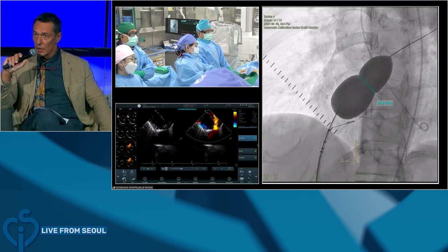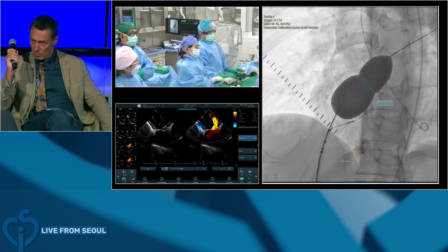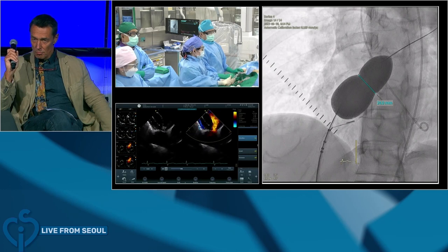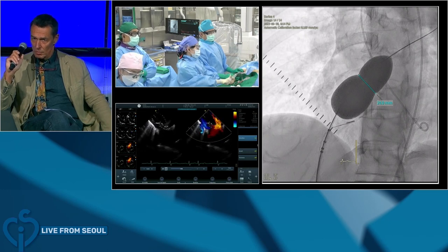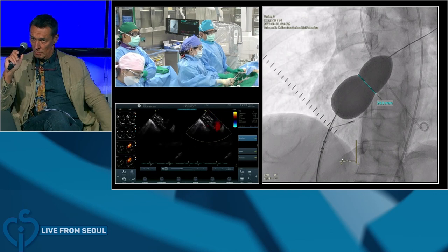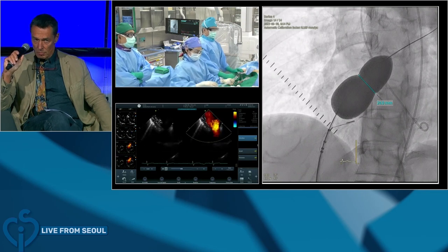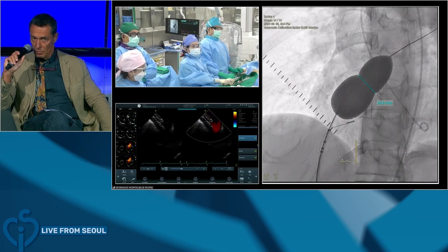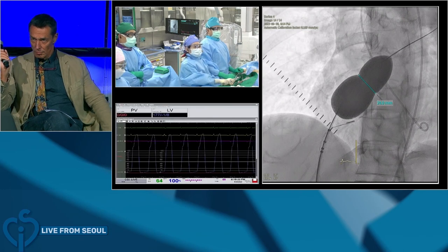Yeah, 24. Peter Ewert has a comment. I think it's a good idea to have this end-diastolic pressure measured, but it would be even more informative if we had the left atrial pressure directly. I don't know whether the balloon is stiff enough, but if you could measure the pressure through the balloon without a wire, because I would like to know how high is the V wave, so during ventricular contraction, what happens with the left atrium? Normally, if you have a restriction, you have V waves which are much higher than these 20 to 30 of the end-diastolic pressure. So what we could do, we could look at the mitral valve inflow with unoccluded defect and with occluded defect to see whether the inflow, the E and A wave, changes significantly.